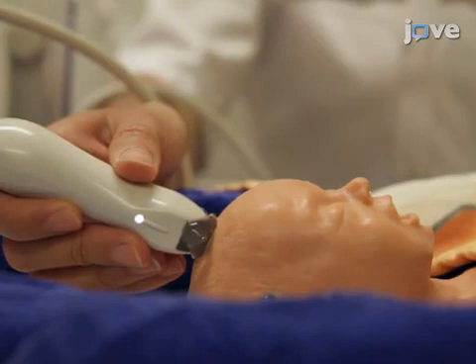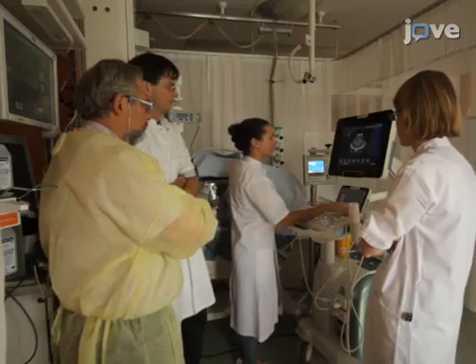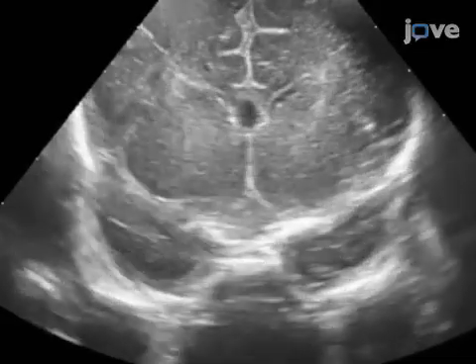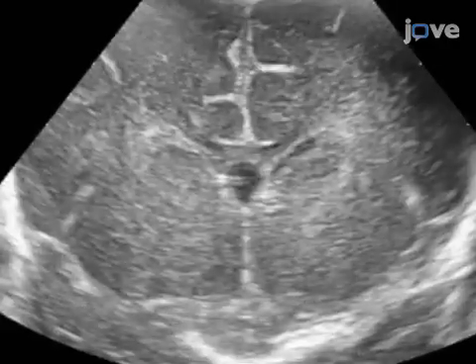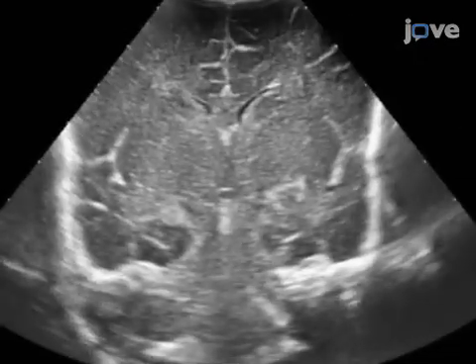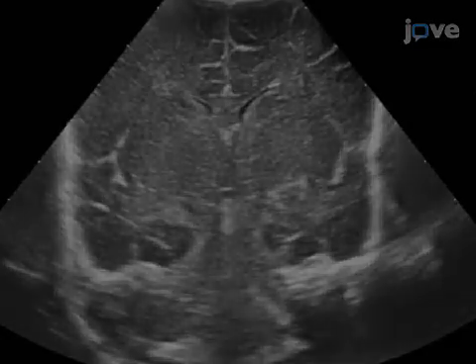To start the imaging through the anterior fontanelle, the left side of the brain will be displayed on the right side of the monitor. Begin recording. Use the first image to adjust the depth, gain, and time gain compensation settings to produce an image filling the sector and containing the cranial contours. Avoid too bright or too dark images, and aim for an equilibrium between the reflections from the nearby and deeper structures.